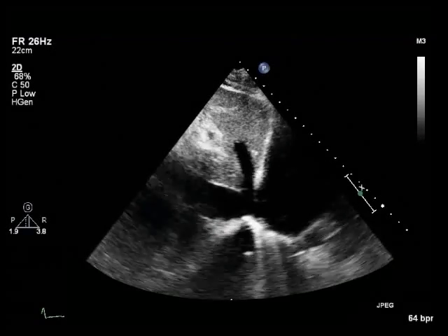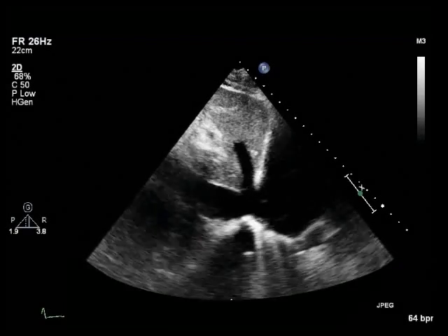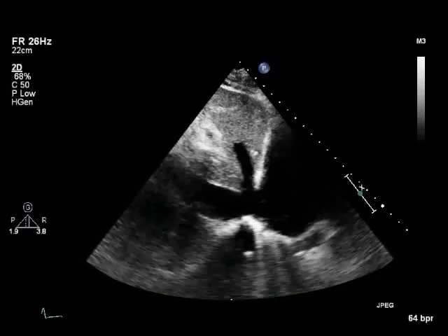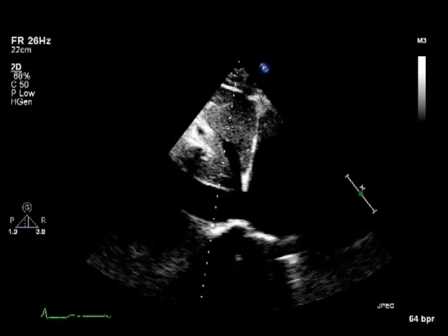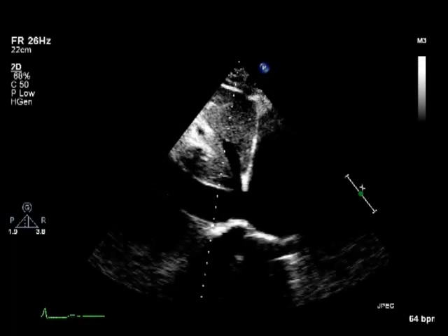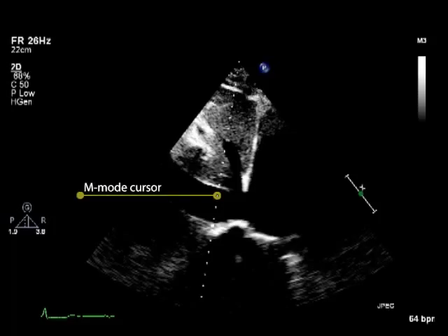An estimation of right atrial pressure can be made from the subcostal view with M-mode applied, by measuring the diameter of the inferior vena cava at end expiration and during inspiration. If the inferior vena cava diameter is within the normal range of 1.5 to 2.5 centimetres and the segment adjacent to the right atrium collapses by at least 50% on respiration, then the right atrial pressure is normal.